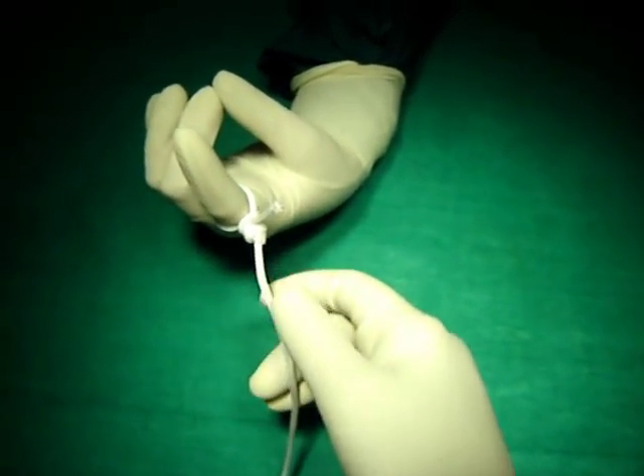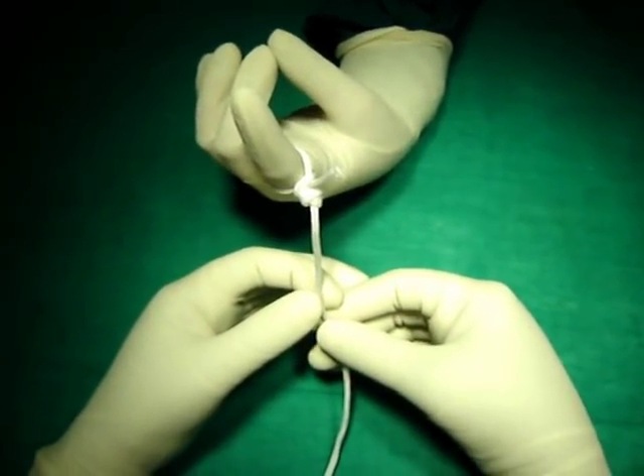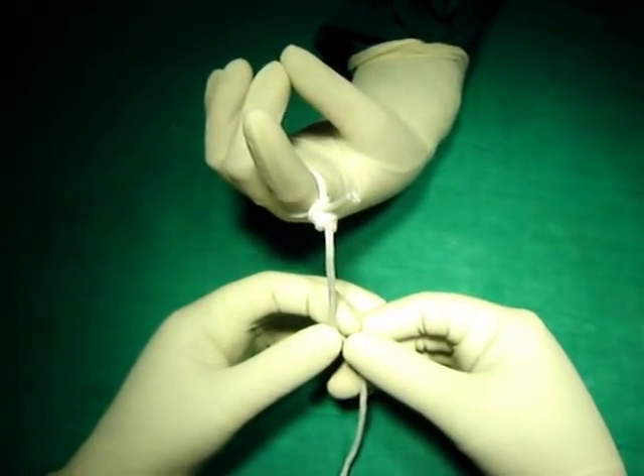Roeder's knot is most commonly used with the chromic suture category. It should be used over the appendix, and it can also be used to tie the cystic duct.